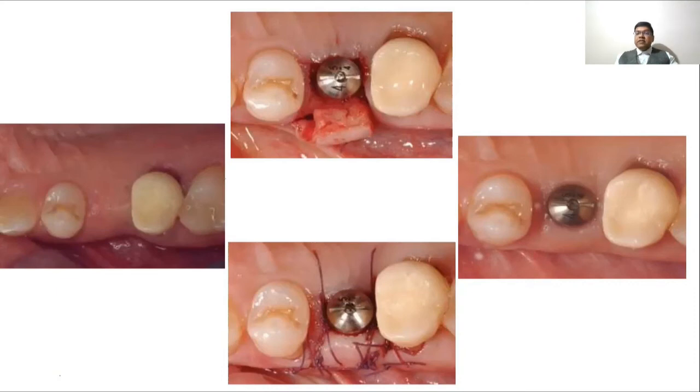Instead of giving incision on the mid-crestal region, the incision is slightly given on the palatal aspect, and releasing incisions are given so as to enable rolling of the flap onto the buccal aspect, and it has been sutured, and the final result is there is good thickness of soft tissue on the buccal aspect of the implant.